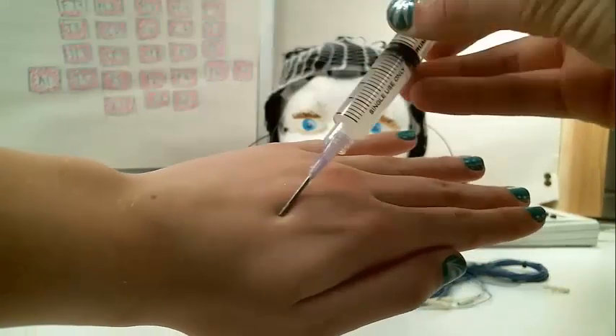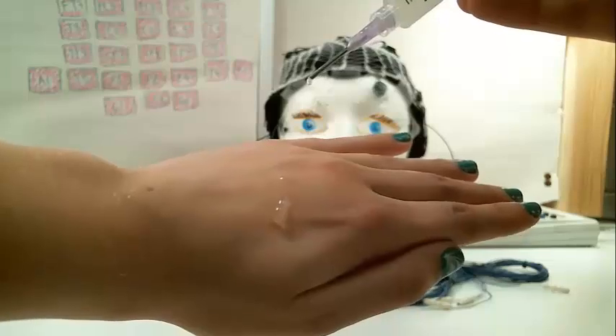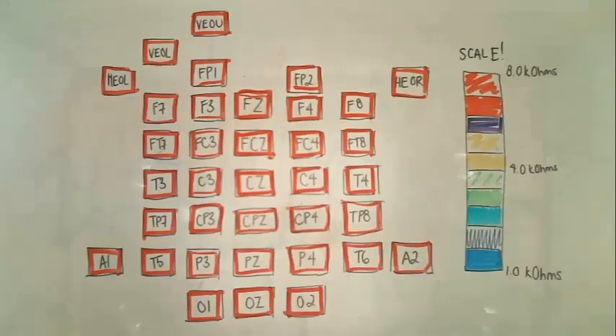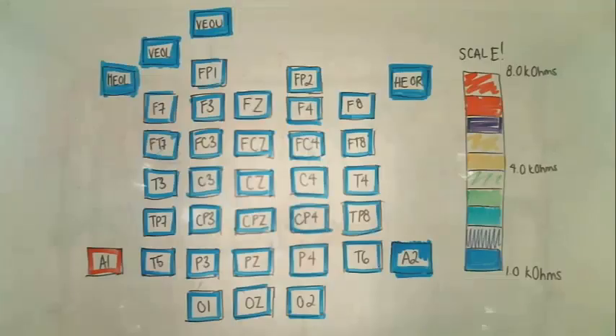After swirling around in the ground electrode for a bit, add a tiny bit of conducting gel as you slowly remove the needle from the electrode. This leaves a small stream of gel connecting the scalp to the electrode. You should then see the screen electrode impedance change color. After you finish all the electrodes, the neural scan program should look something like this. Notice that one of the mastoid electrodes remains pink. The electrode will stay that color because it is the reference, not because there is an error with the electrode.